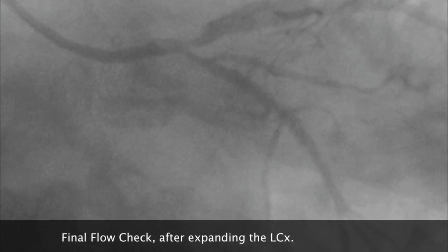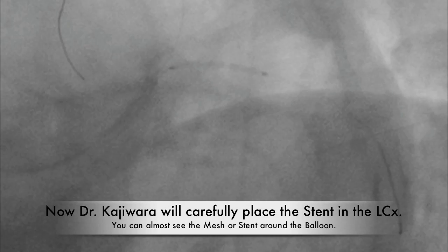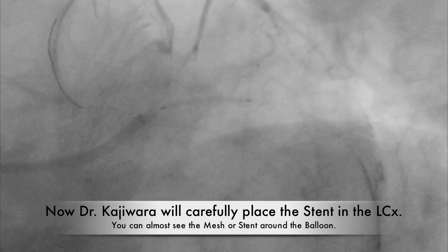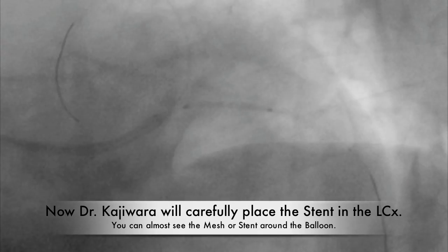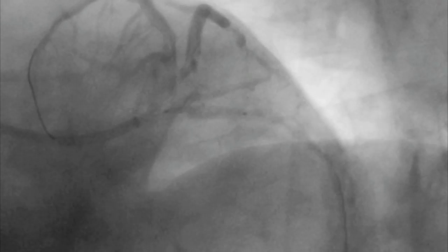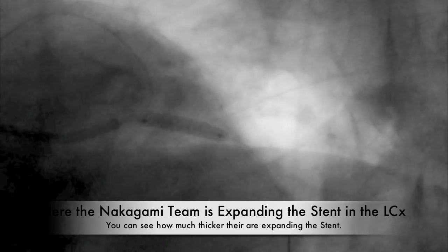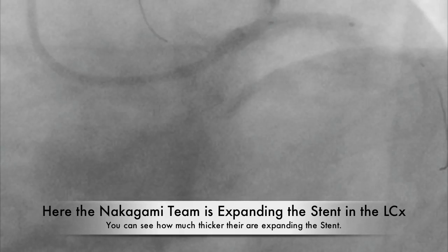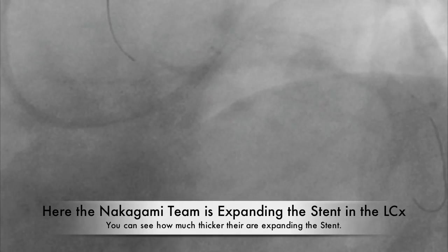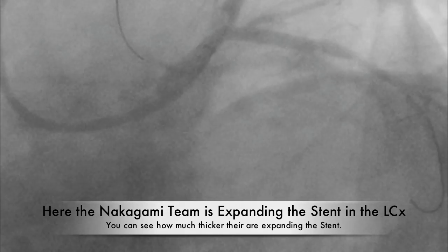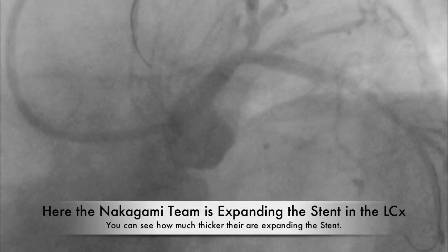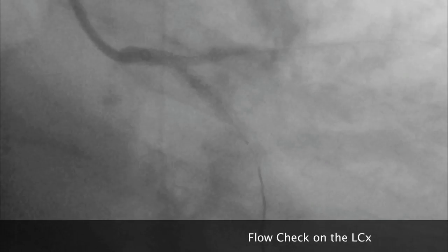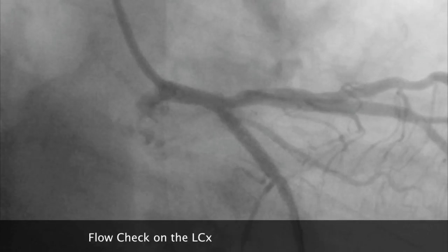There's a final flow check after they expanded the LCX. Now Dr. Kajiwara carefully places the stent in the LCX — you can kind of see a mesh on the balloon itself before they start expanding it. The Nakagami team is now expanding out the stent on the LCX. You can see how much thicker it's getting and staying with the stent in place. They're expanding the stent one more time, then doing a flow check — it looks much thicker now.